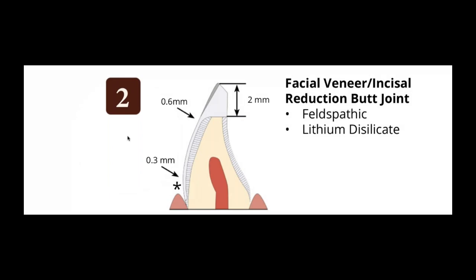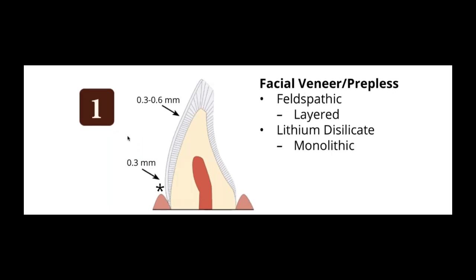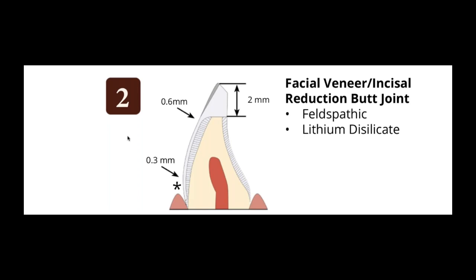A little caveat here, just to be clear. With the first prep that I showed you, I'm saying you need 2 to 3 tenths gingival, or maybe 3 to 5, 6 tenths facially or towards the incisal. But that is also based on tooth position, right? If the teeth are already lingually inclined, you don't need that reduction because you're bringing the tooth out. If the teeth are out too far facially, you're going to need more reduction to get the tooth in the ideal position. So there is no set standard of always reducing this amount or that amount. It has to do with the orthodontic position of the teeth more than anything else.